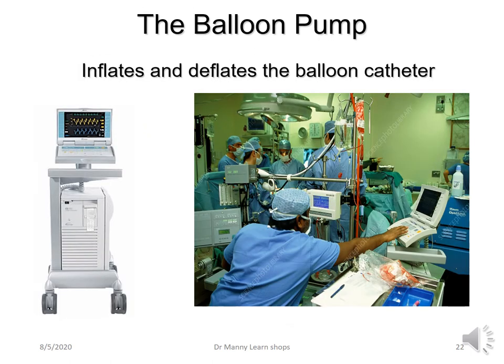Then you've got the balloon pump itself, and this is just the console or the computer that inflates and deflates the balloon catheter. I'm just using Datascope, because it's a nice little balloon pump, and it's one that I've had considerable experience with. It's very user friendly, but I'm not promoting the manufacturer in this session.